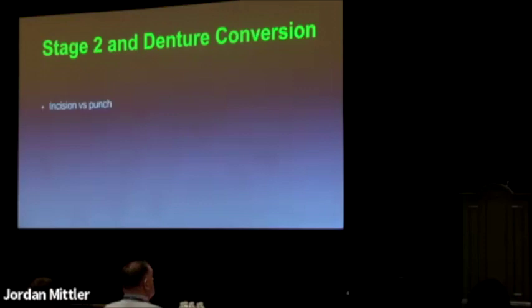There's a lot of discussion, especially with my residents, incision versus punch. You know, they want to know, oh, can I just do a punch? Everybody wants to do a punch. Well, any of the periodontists and oral surgeons around here, the most upsetting thing in the world is watching keratinized tissue go in the garbage. So I really do tend to go more towards incision than punch, unless I've got just so much keratinized tissue and I can see where it is.